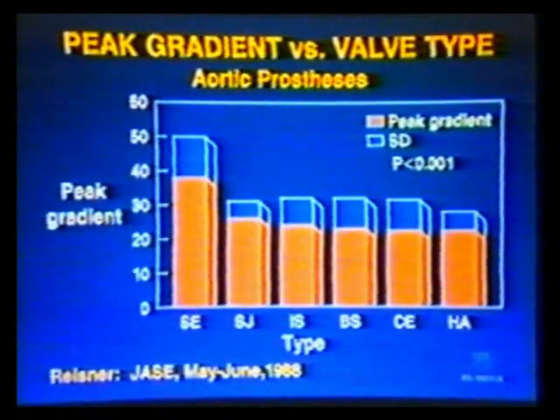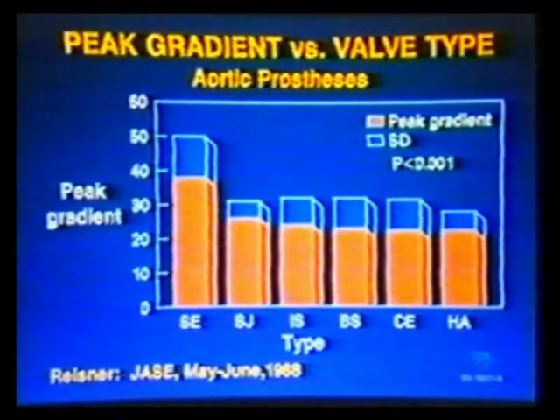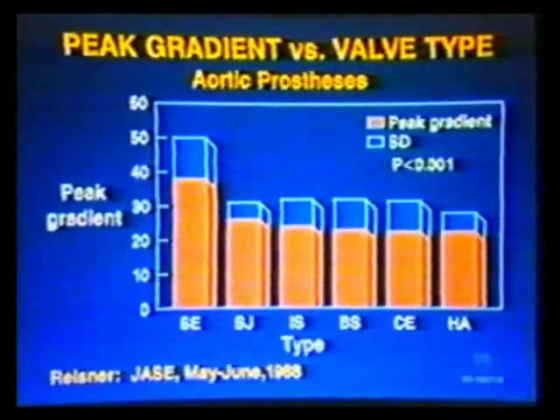In 1988, Reisner and Meltzer reviewed the literature for Doppler evaluation of prosthetic heart valves in patients who were clinically normal. They published the accumulated data for over 1,000 prostheses. Of these, 494 had aortic prostheses. The maximum instantaneous gradient had been calculated for each prosthesis using the simplified Bernoulli equation.